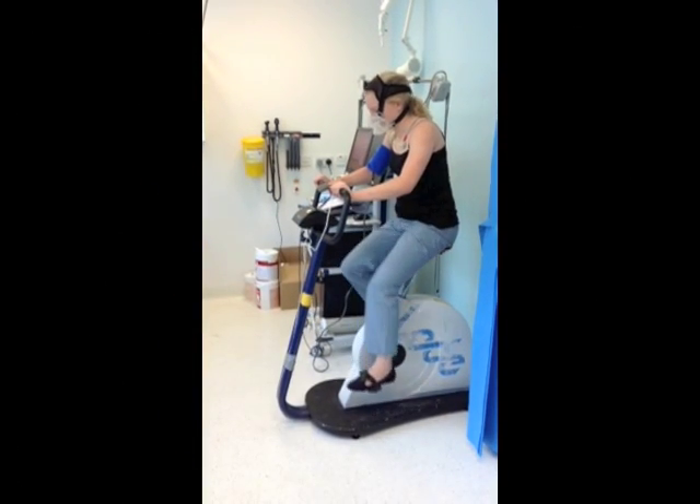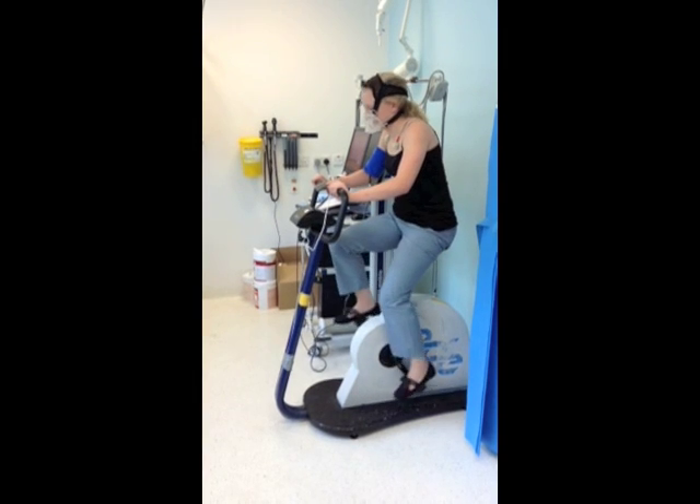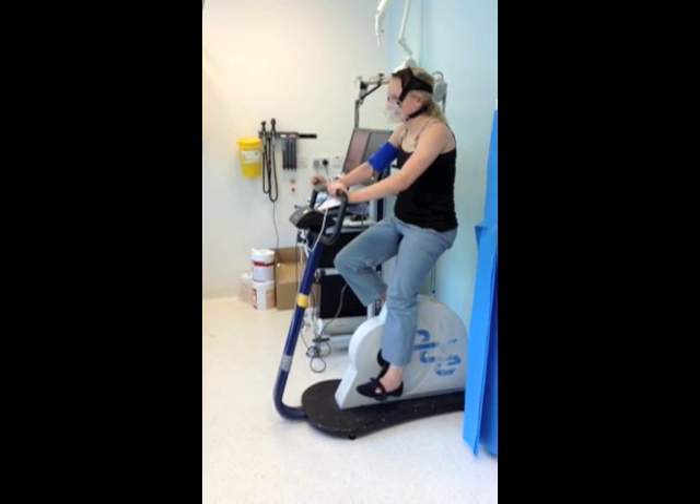Once the patient can no longer cycle, the resistance is removed, but the patient will keep cycling very slowly to warm down. The patient will then stop cycling but stay seated on the bicycle for a couple more minutes.